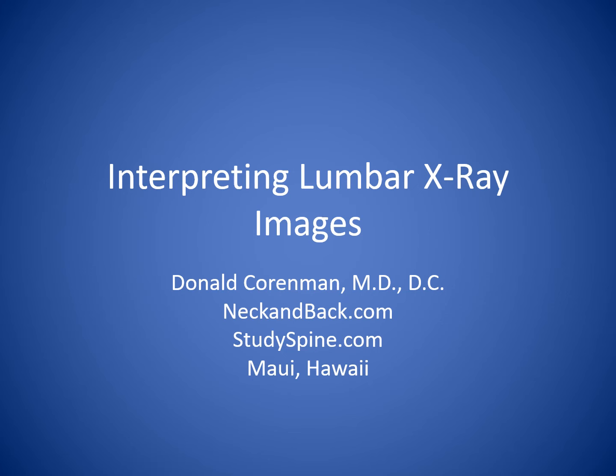Hello, this is Dr. Corenman, and we're going to be discussing today interpreting lumbar spine X-ray images.